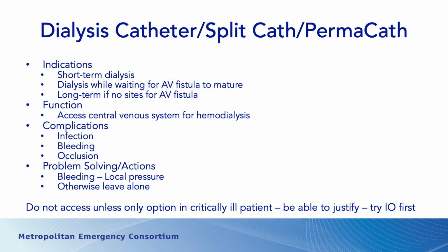We often discuss whether or not EMS providers should access these devices in a critically ill patient. My response is do everything you can to avoid accessing these devices. These devices are special. They have to be maintained in a pristine state. The nephrologists, the kidney doctors, and the dialysis centers get really fussy about who touches these devices. If you touch these devices, you should have a gown and gloves on, a face mask. You should clean the area, follow appropriate sterile technique. Really, we need to stay away from these devices.